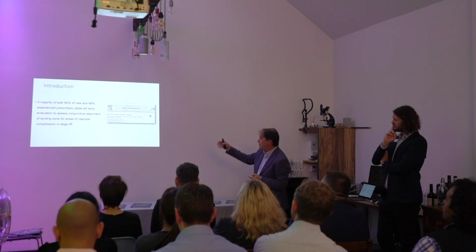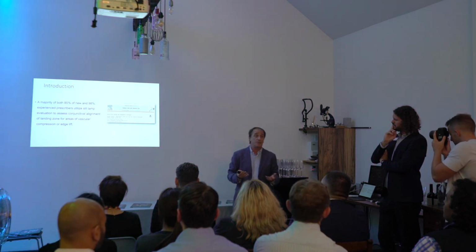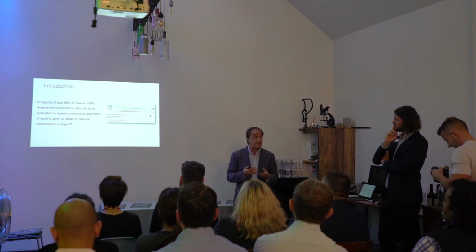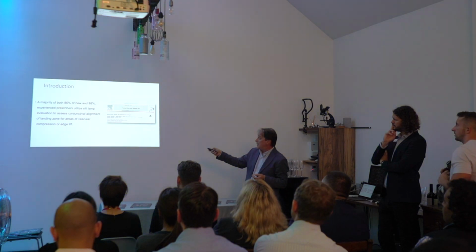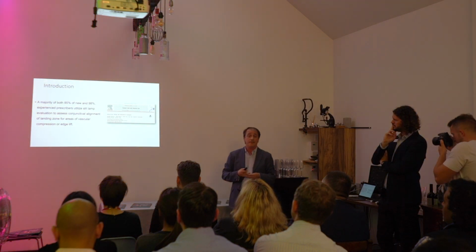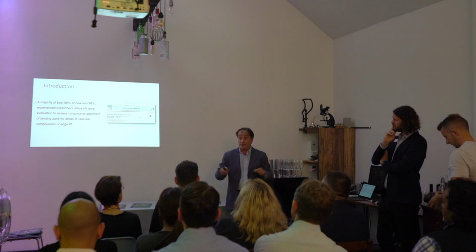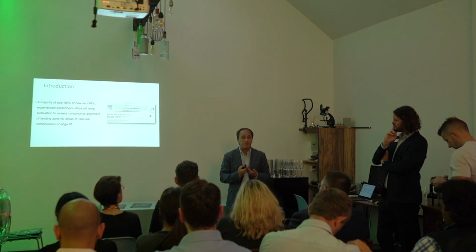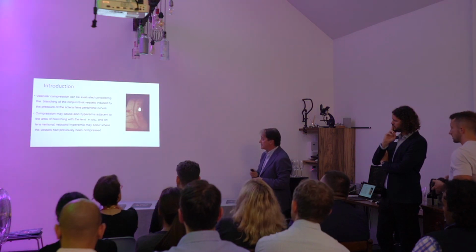And in another interesting paper, there was a survey to understand which instrument was used to evaluate scleral lens fitting. The results are that 85% of new and 98% of experienced practitioners use the slit lamp to evaluate the behavior of the lens on the scleral surface. And so, again, we use a subjective approach to evaluate the relationship between the lens and the anterior segment.